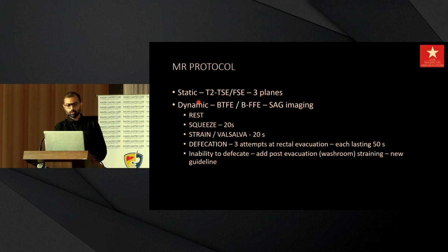But what I'd like to mention is what MR defecography is doing. It is allowing us to evaluate the dynamic nature of the pelvis. Okay? The pelvic diaphragm is somewhat like a thoracic diaphragm. Only thing, it is not moving continuously upwards and downwards, but it's a musculo-tendinous structure and it is bound to move with increased intra-abdominal pressure. It is meant to happen so.